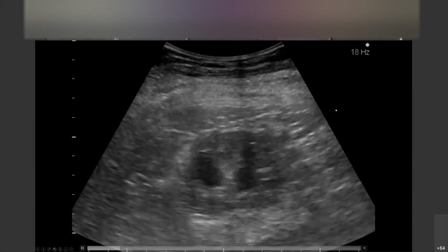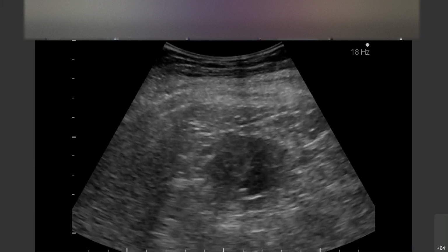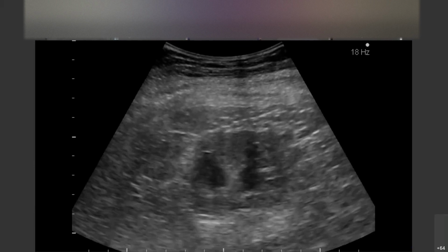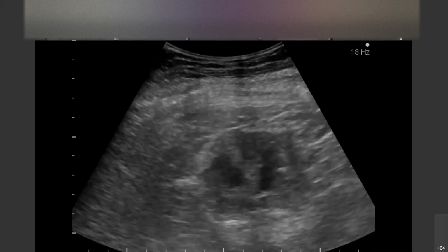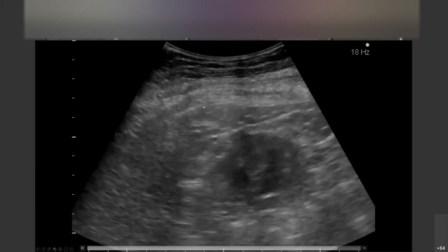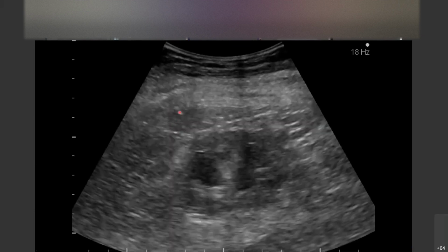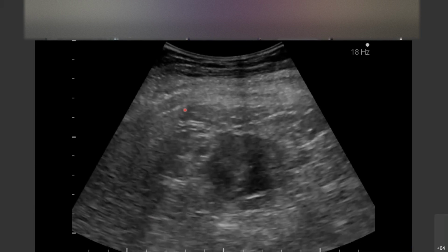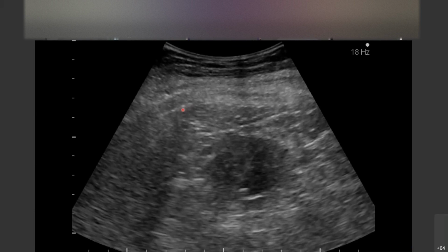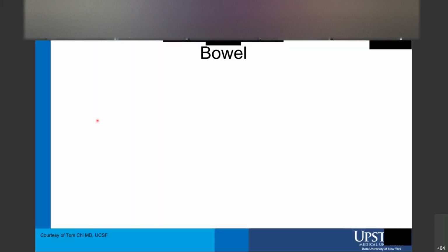Here we see as the patient's breathing, on the top left, you'll see pleura. It's the little white line that comes in, and there's posterior shadowing to that. Up here where the laser pointer is. Again, one more time, coming in and breathing out. So that's a nice way to avoid injury or a pneumothorax.